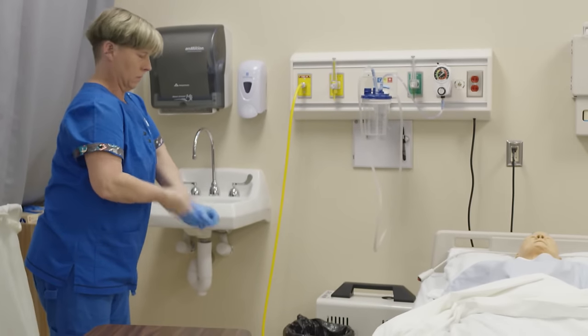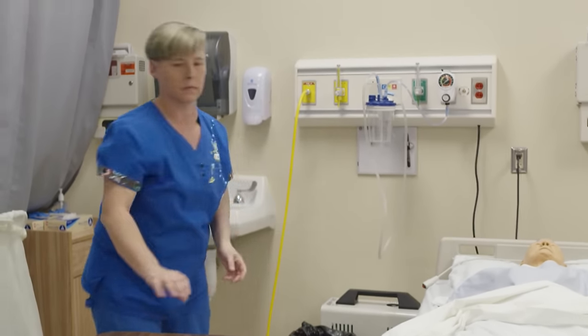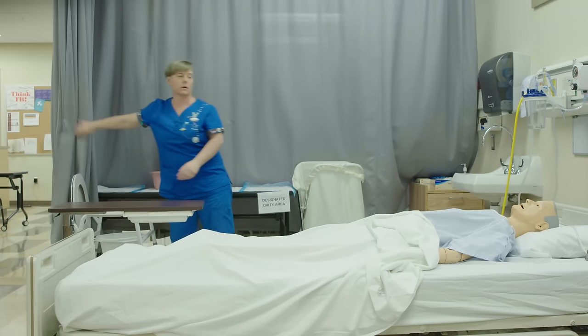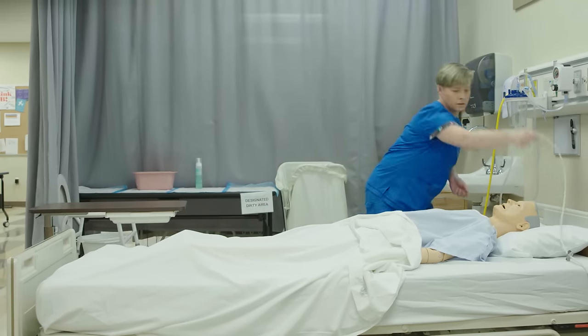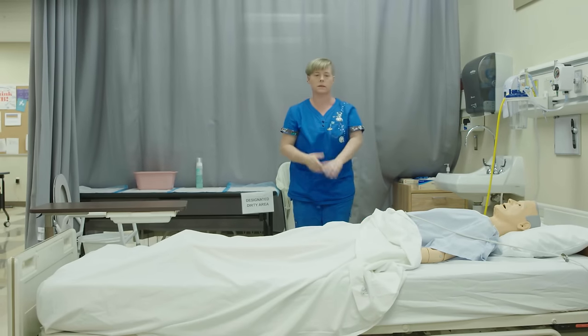After disposing of used linen and cleaning equipment, removes and disposes of gloves into waste container and washes hands. Open up the curtain. The candidate provides a signaling device and ensures the bed is in low position. I'm gonna wash my hands and the skill's complete.